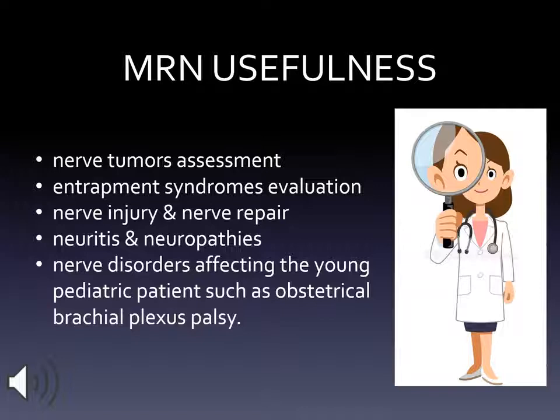Utility for MR neurography has now been established in nerve tumors assessment, evaluation of entrapment syndromes, nerve injury, evaluation of repair, neuritis, and neuropathies, and for evaluating nerve disorders affecting the young pediatric patient, such as obstetrical brachial plexus palsy.